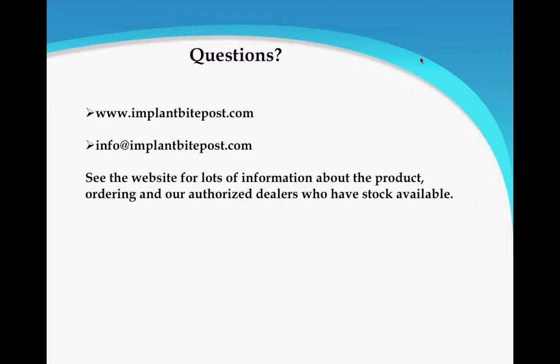Here's one I think we've answered, but I'll try it. Why can't I take the bite off the tissue? Again, the test of time has been that you cannot take accurate bite records off tissue. As Dr. Mark said a little bit ago, sometimes you can get a vertical record off the palate because the phenotype of the tissue is hard and bony, and you can get relatively close there. But if you're going to use tissue, you're going to have a problem. I have talked to dental laboratories all over this country as I've presented this, and the people that are using it have great success.